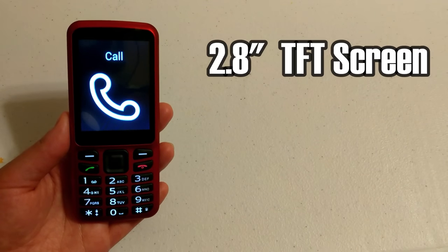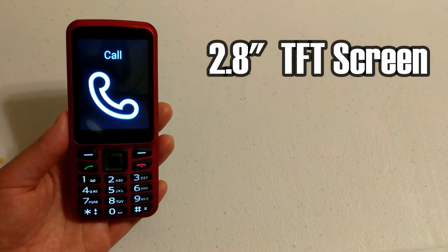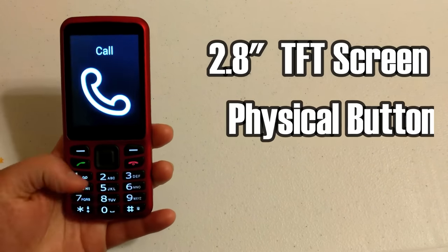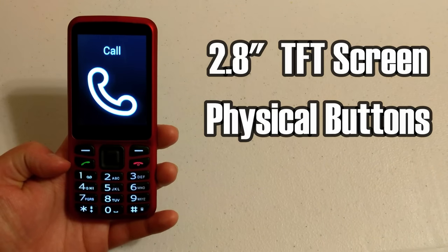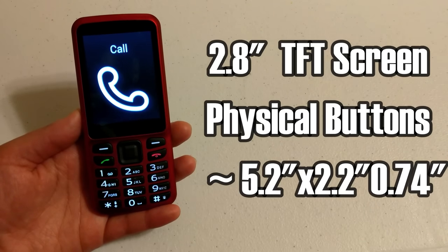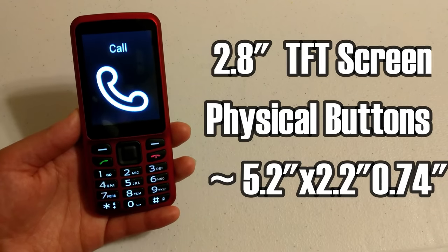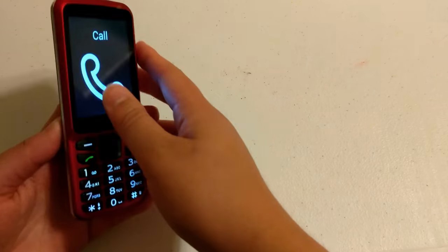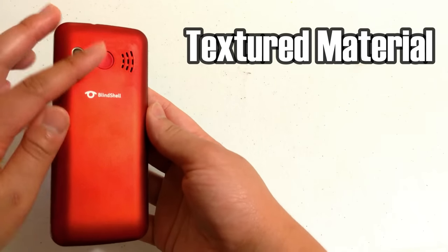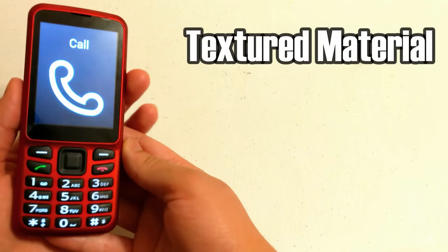It has a 2.8-inch TFT display, which you can actually turn off — like the screen curtain for iPhone and the dim screen for Android — and you can do that in the settings. Below the screen it has physical buttons which are really tactile, and it's kind of like this candy bar older-style phone. It's approximately 5.2 inches high by 2.2 inches wide by three-quarters of an inch thick. I have the red version, and it has a really nice texture on the back — it's plastic but textured so it doesn't pick up fingerprints as much.